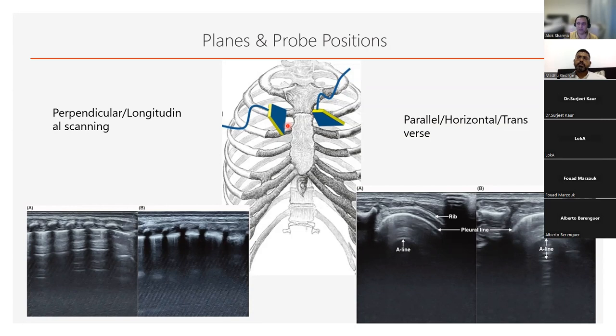That is what you want to diagnose. That is what you might want to treat. On an extremely preterm baby, doing the posterior regions is going to waste time for you. And that's where I would say that you need to be pragmatic about the approach.